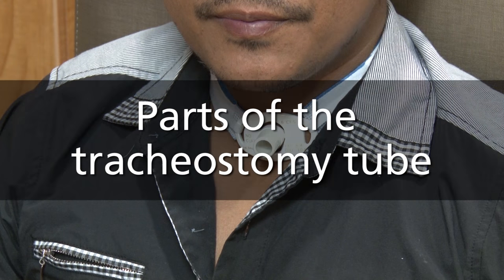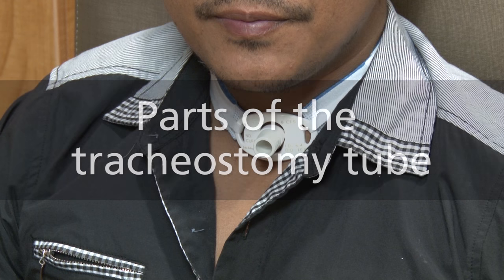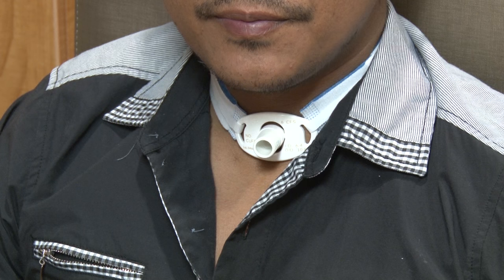There are many different types of tracheostomy tubes. This video will show you the important parts of the tracheostomy tube. For short, you can say trach tube.